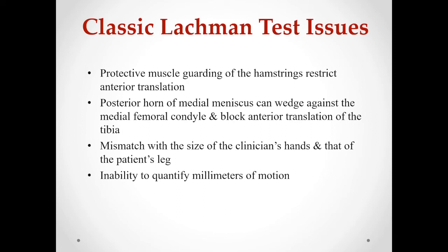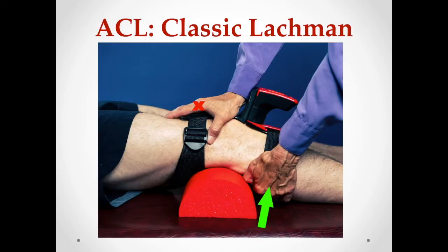Add to that the fact that that movement may only be 5 to 8 millimeters. Right? The ability to quantify that motion is quite challenging. That's where the Mobilator comes in. This allows you to use the same classic Lachman technique, but to quantify the mobility of the joint.